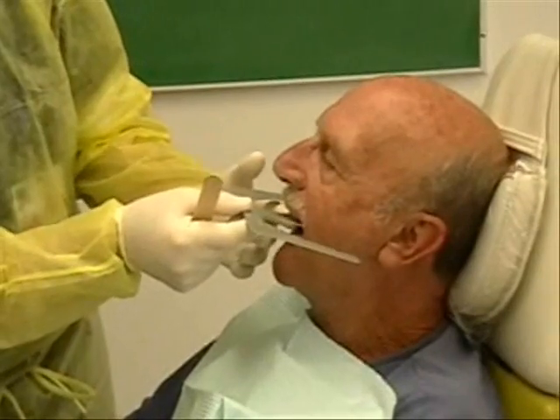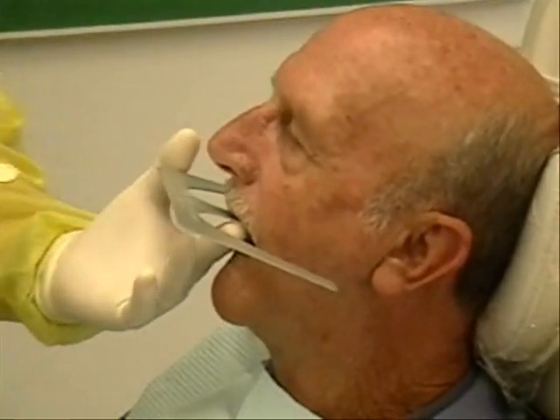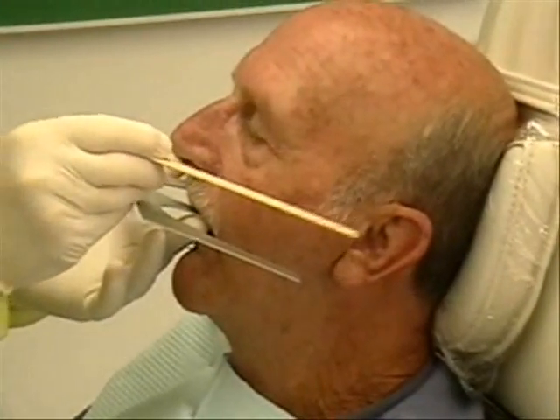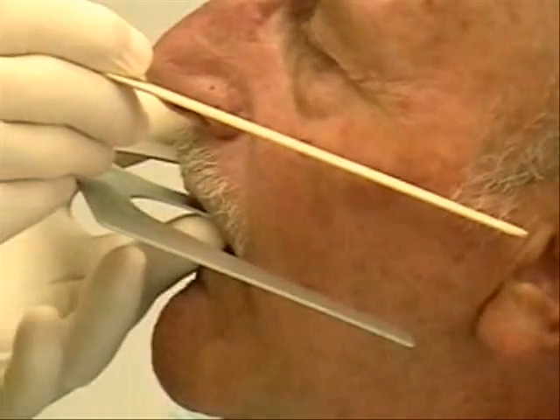This little thing is going to show us the angle of your step. And ala tragus — tell me if I'm in the right place, gentlemen. Yeah, you're looking pretty good there. Parallel to the ala tragus line?